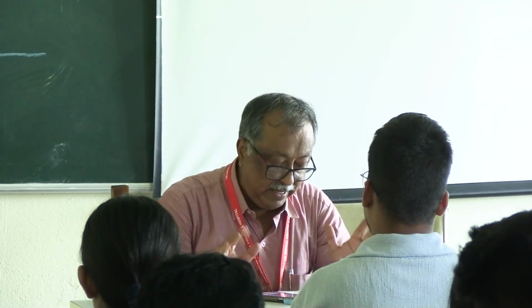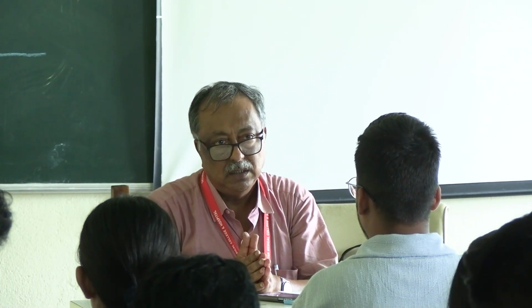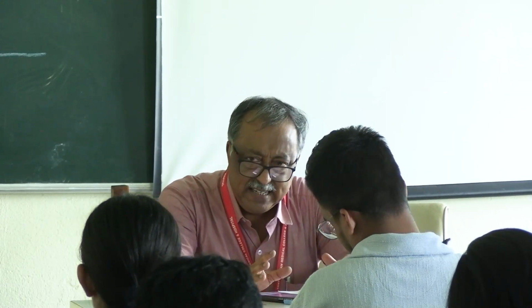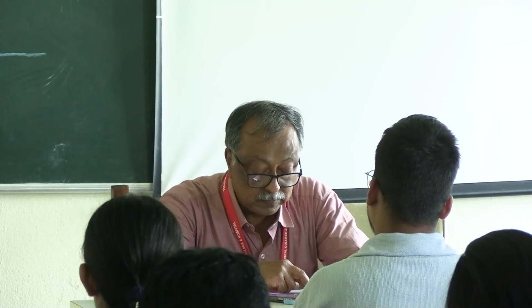Now, normally, it is 6 meters at which you can whisper or converse. The normal hearing person can listen. This is the whispering test. That is a very easy test you can do anywhere. Now, the well-known tuning fork test, about the Rinne's and Weber.